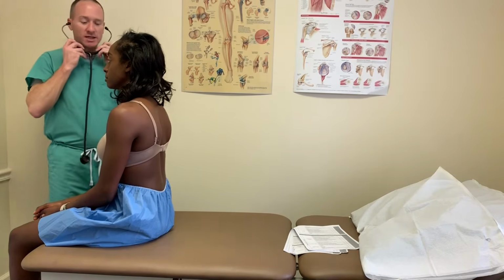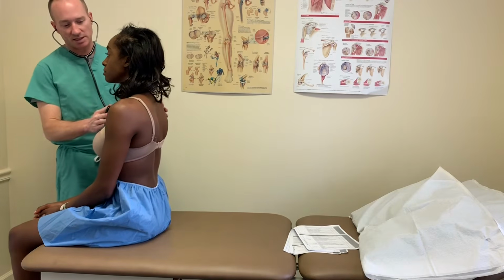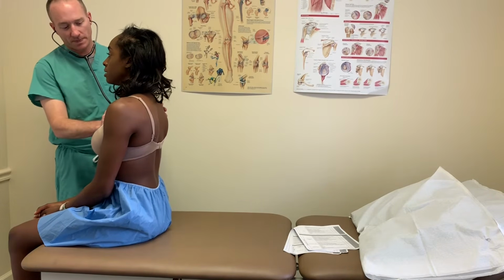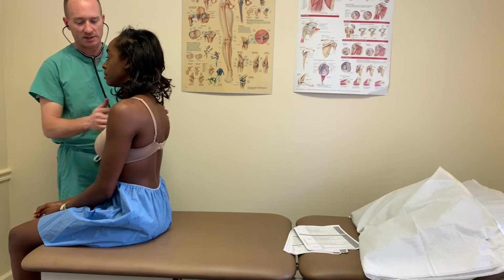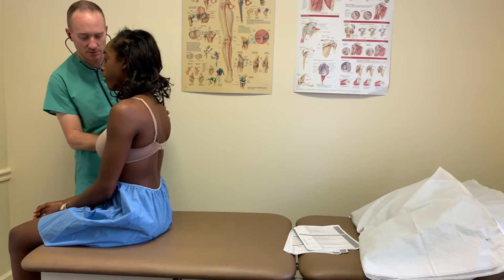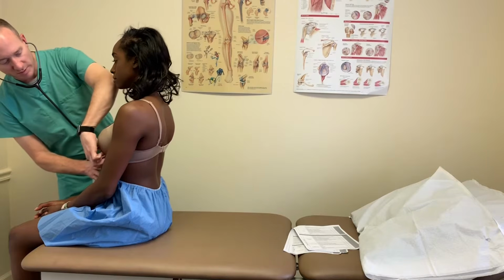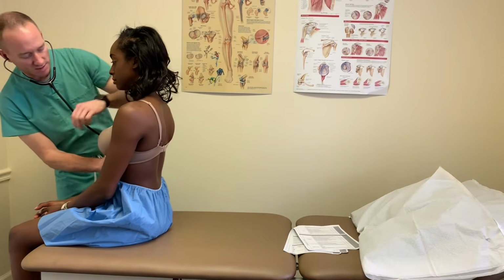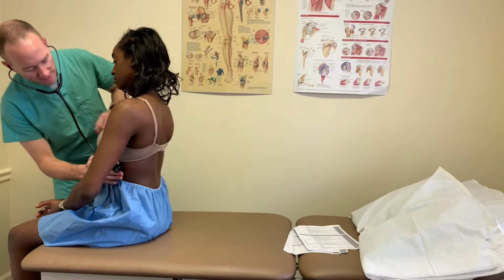Okay, I'm gonna auscultate the anterior lung fields, okay? So each time I touch the stethoscope, take a breath. Again, listening for the bronchial sounds here. Moving down, bronchovesicular. Gonna probably put this under your bra slightly, on the side.